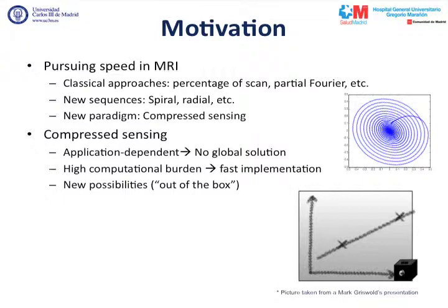And on top of the classical approaches such as partial Fourier, parallel scan, even parallel acquisition, in recent times a new technique has appeared called compressed sensing, that to some extent is sort of a revolution in this area because it apparently allows you to break the Nyquist limit.